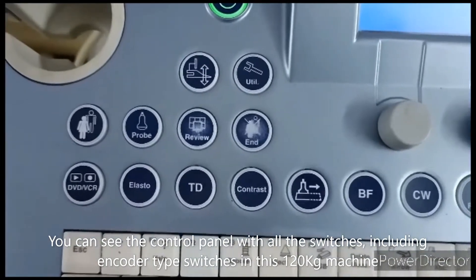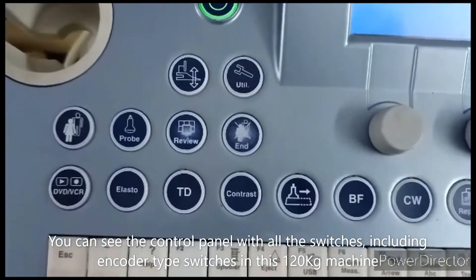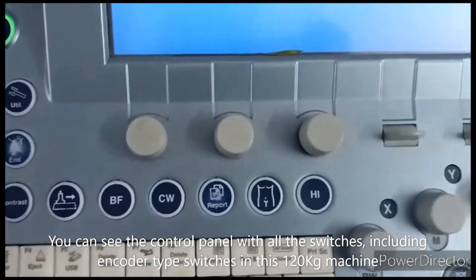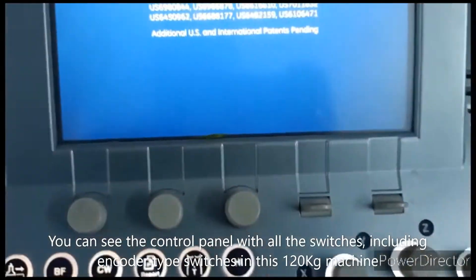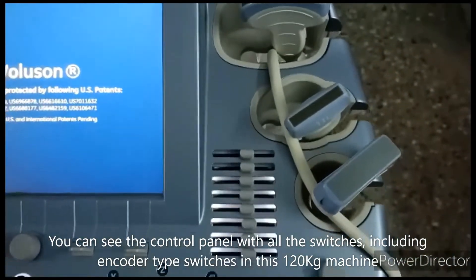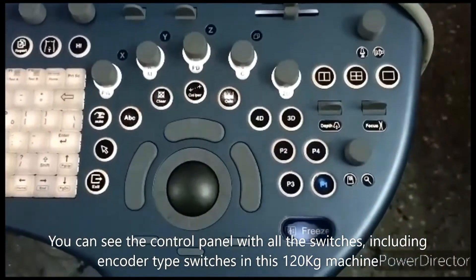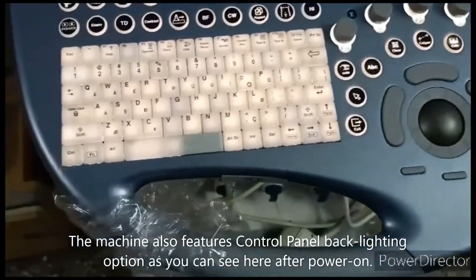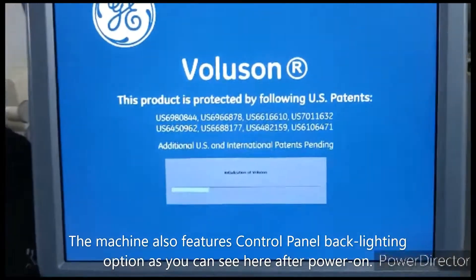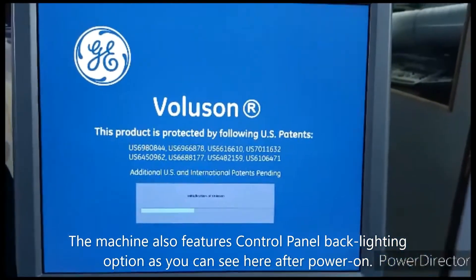The control switches cover utility, patient admission — everything is available here. You can see an encoder-type switch oriented to the control panel. Once boot is completed, you can see the options in the touchscreen. This is the alphanumeric keyboard you can see in the display — the machine is still booting up.